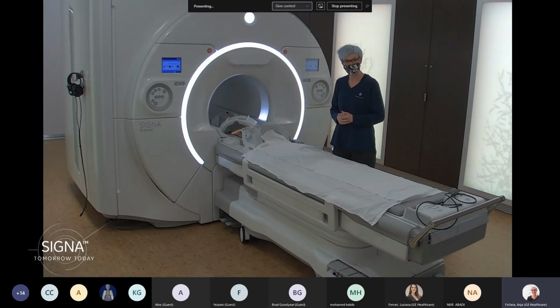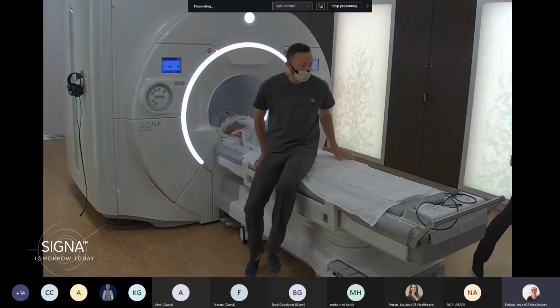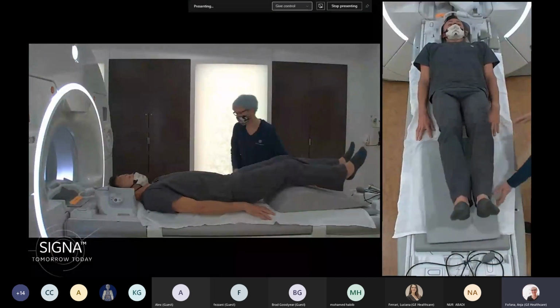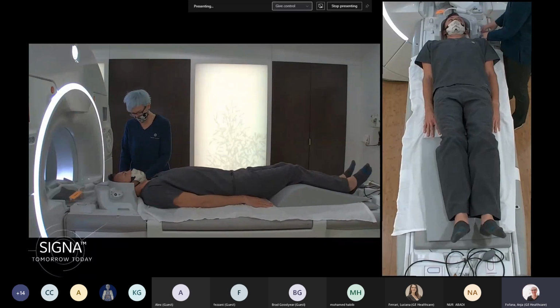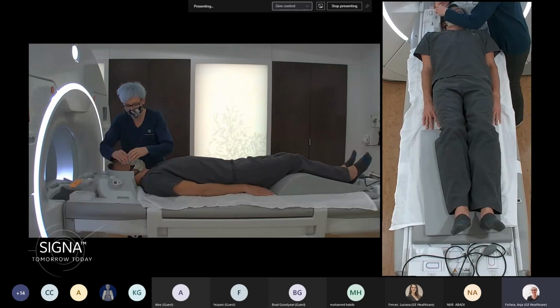Okay, you come in. Just lay on your back. Here, there, foot, please. Put a knee pillow underneath. Awesome. Make it comfortable. Okay. You can keep your hands up. So I just put some pillows right in there and make your head better, so it's enough hold.